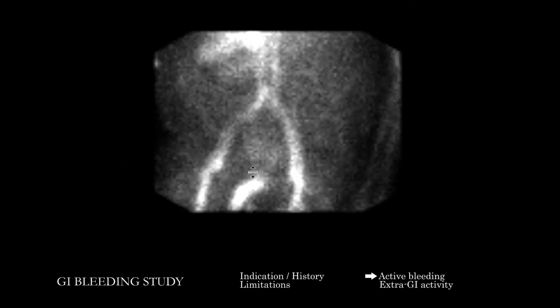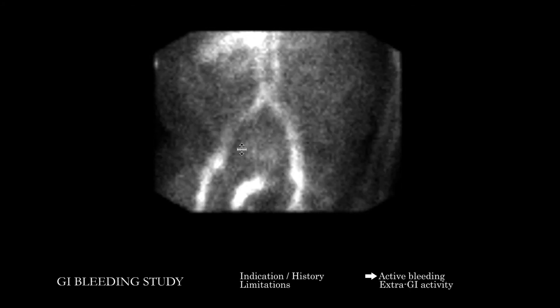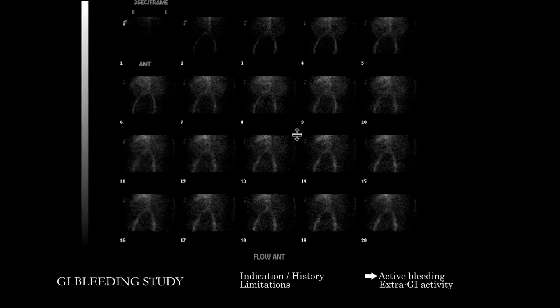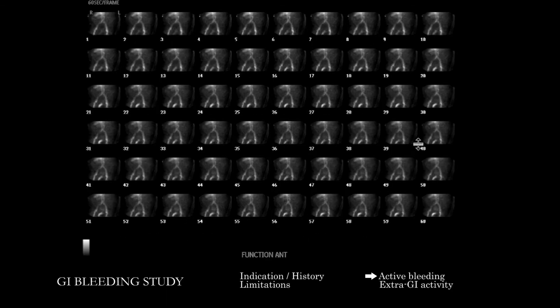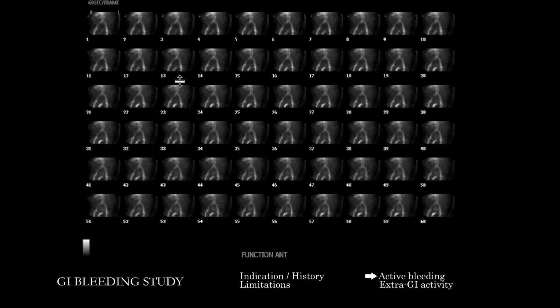When we correlate with anatomic imaging, we can correspond this to urinary tract activity, genitourinary activity, and a normal penile blush on this male patient. As we go further, we can get these summative images which show the activity over the whole time course of the study, both in the flow and blood pool phase, and then where we would expect abnormal GI activity.